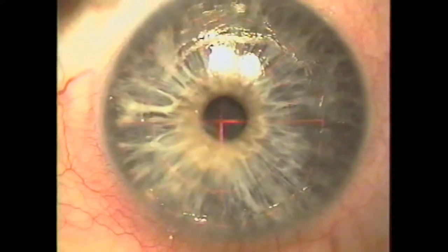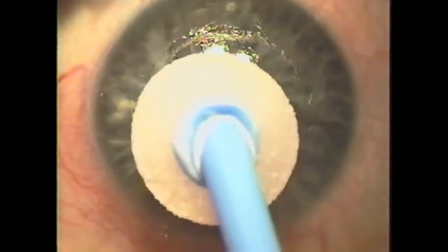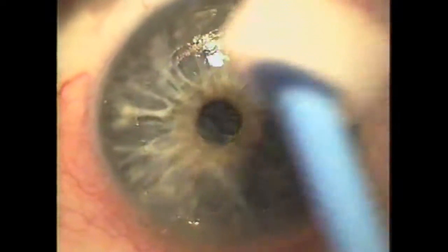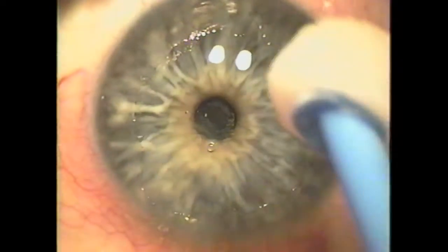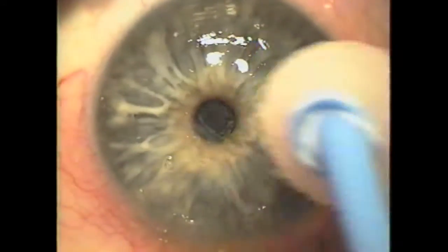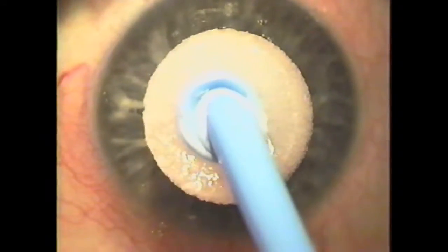At this point, we will apply mitomycin C for about 30 seconds. You may even rub the surface or gently place this disc-shaped sponge soaked in mitomycin so it applies to the central cornea.